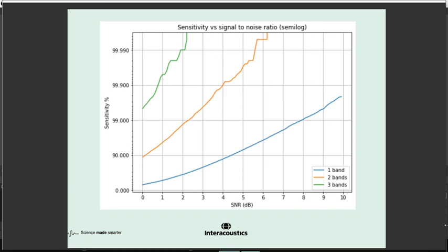And so we can keep adjusting these parameters, how much signal to noise, how many bands, and assess what sensitivity we want. Most people settle for 6 decibels and 2 bands. Once they do that, you end up with a 1 in 10,000 chance with our particular equipment of having a misreported case in a hearing impaired population of 10,000 people. So the chance of that is very, very small, and that's one we can live with uncomfortably, but we can live with.